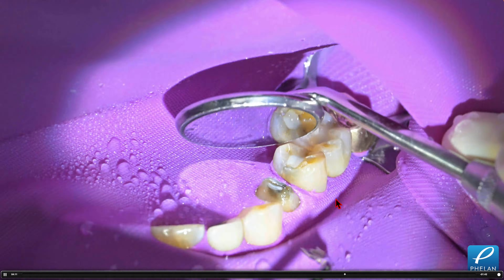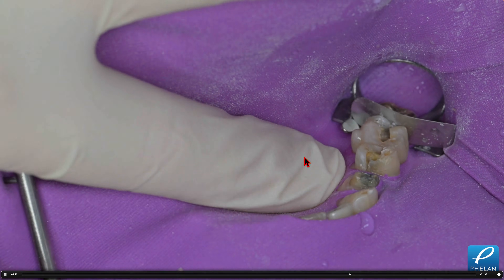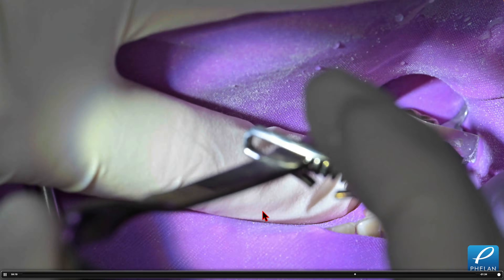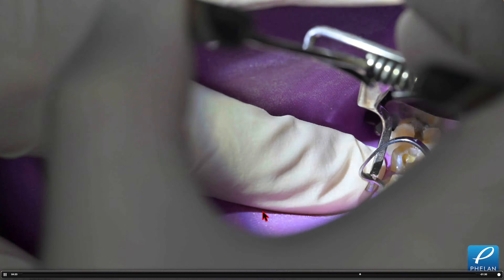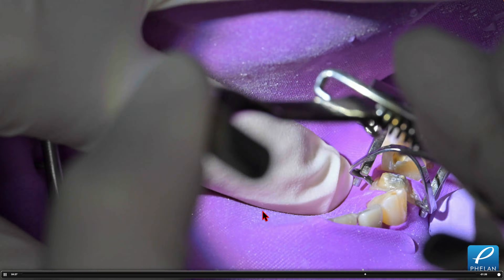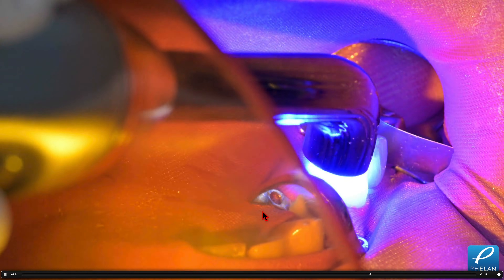If I'm going to do a core buildup on this bicuspid, the rubber dam is definitely in the way. You can cut the interproximal of the rubber dam, or the other option is to seat a B4 clamp over that prep. Here's a B4 clamp — I'm going to seat it over this and do the whole core buildup with the B4 clamp.